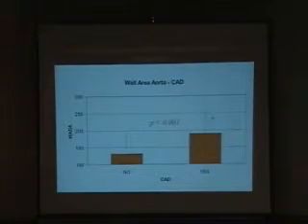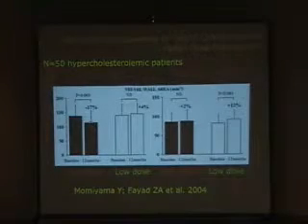And we are doing currently analysis on stroke patient, diabetic patient, etc. So you can imagine the kind of result. And it's not surprising why we're finding this, because we are measuring the disease itself. We're measuring the plaque that we're seeing. And another thing that you can do is obviously putting this in the setting of lipid lowering or any kind of intervention, because this is what you want to do. You want to do some kind of intervention.